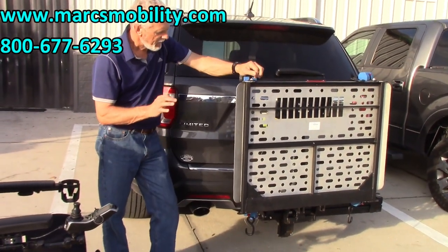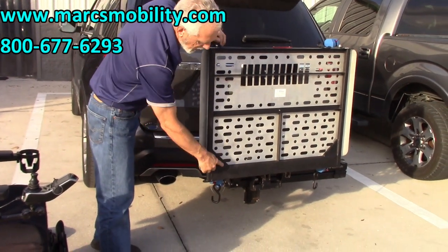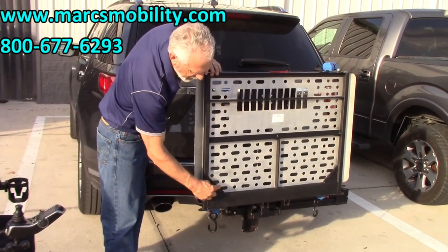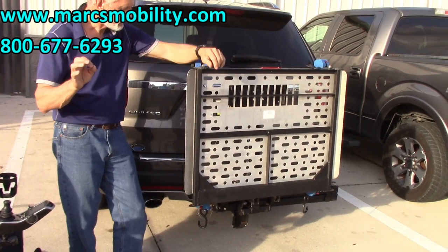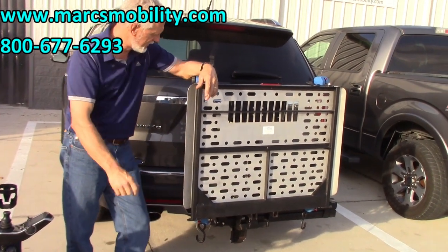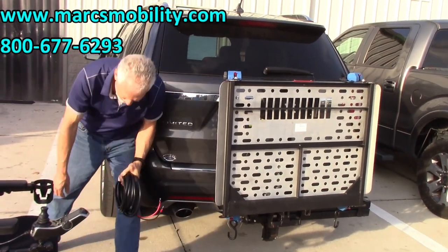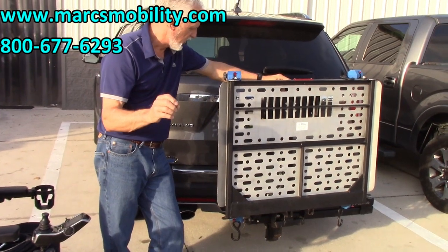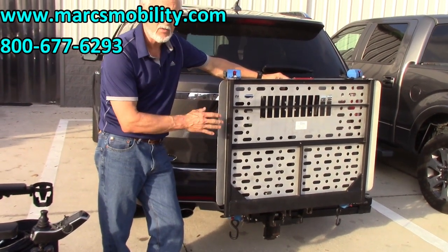Let's recap. This is the Harmar AL 500 HD lift. The HD model has a welded piece — angle iron — on both corners of the bottom platform to reinforce it. That's how you know you have an HD lift with 400-pound lifting capability. Always run your engine when you raise the chair up — you don't need to when going down. Use the pin, use the cable we send with it, use the harness, and use common sense. You'll get many years out of this lift. I highly recommend it if you have a heavy power chair.